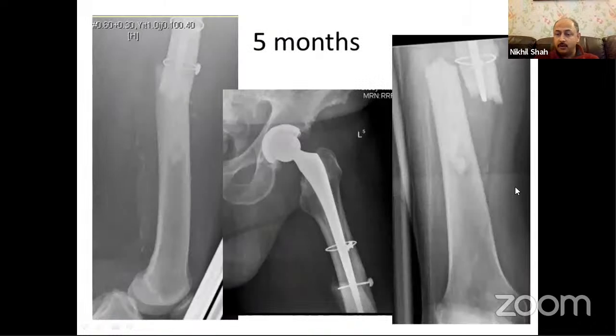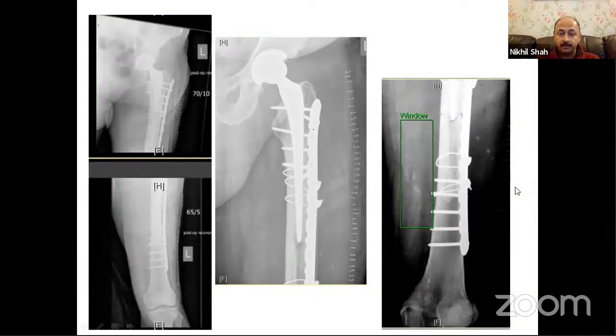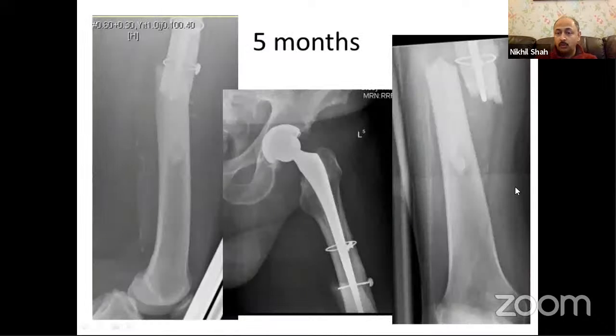At 5 months, unfortunately, he had a very minor twist and he fractured exactly at the tip of the stem where the original stress riser was present. So now we are probably back to square one. We have the same problem again. We have a proximal femur that has a lot of cement in it, and we have a long cement column in the distal fragment. And now the options become a lot more difficult. So again, we discussed, what do we do now?